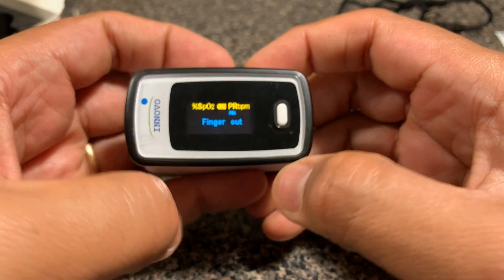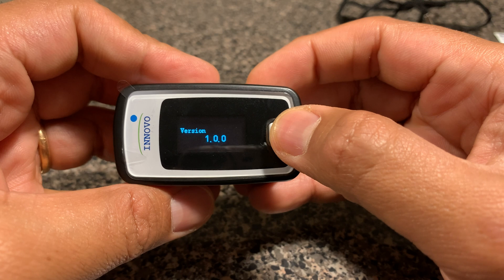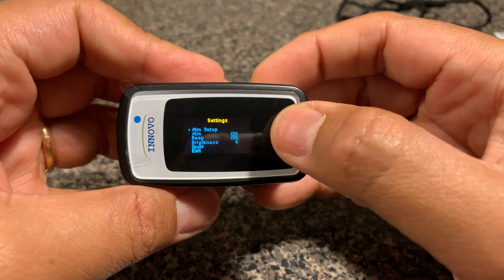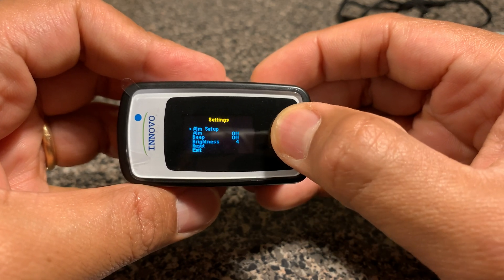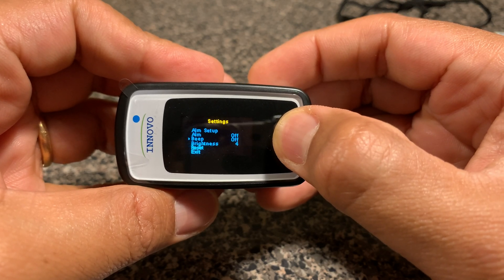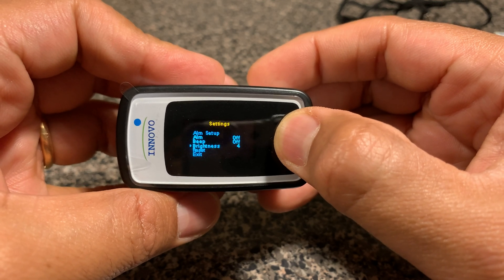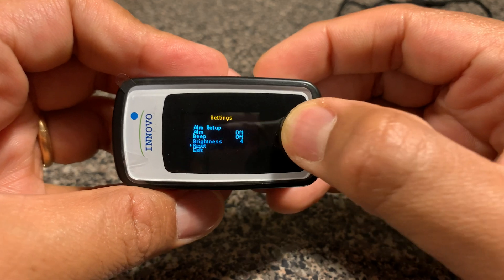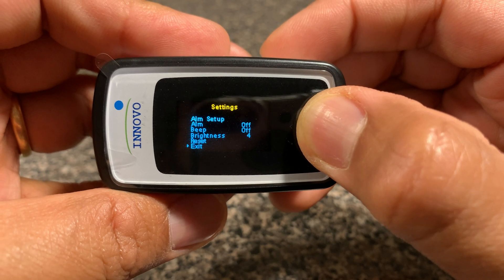Let me show you the beep and alarm function. If I press the button for about three seconds, it opens up the settings menu. There's an alarm setup — by default the alarm and beep are turned off, but I can turn them on. There's also brightness control, which defaults at four, and a factory reset option. You can press and exit out of it.